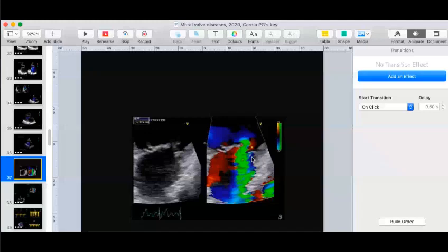Objectively quantify the severity. Much more reproducible. Okay, so better reproducibility. Anything more than that? Okay, so LA pressures and all. Yes, so that is the point here. It is not going to be affected by the flow rate. It doesn't matter how high or how low the flow rate is. This will not vary. So that is the most important thing.